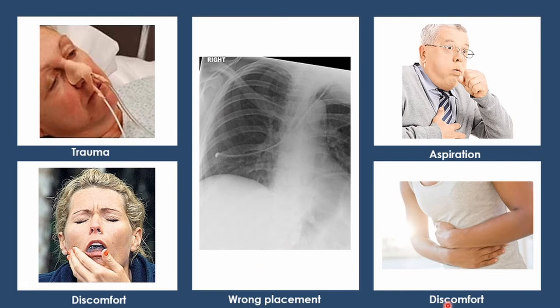Discomfort. A conscious patient may feel a little discomfort while the NG tube is passed through the nostril and into the stomach, which can induce gagging or vomiting. A suction should always be present and ready to be used in this case.